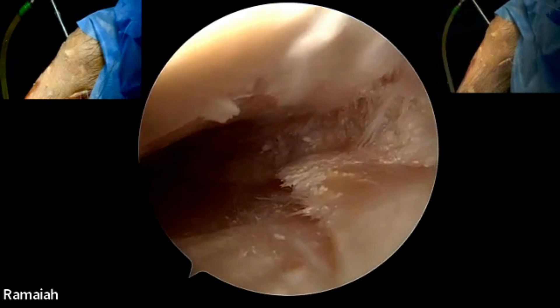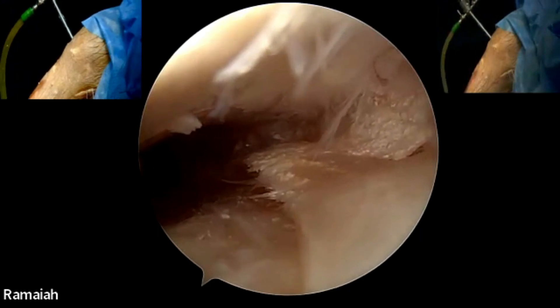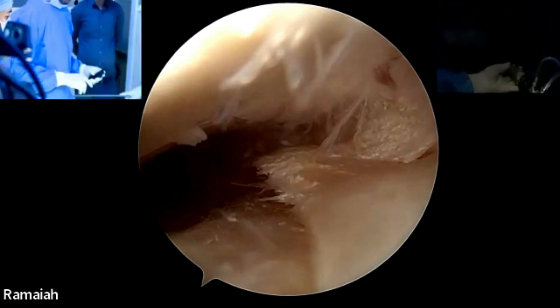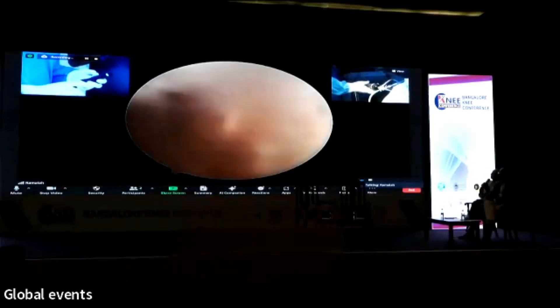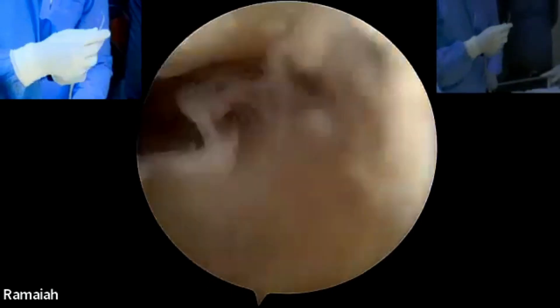Let me show some instruments first, because one has to be familiar with the instruments for doing inside-out repair. This is a zone-specific navigator, and we have several types of needles available with curvatures on the tip.